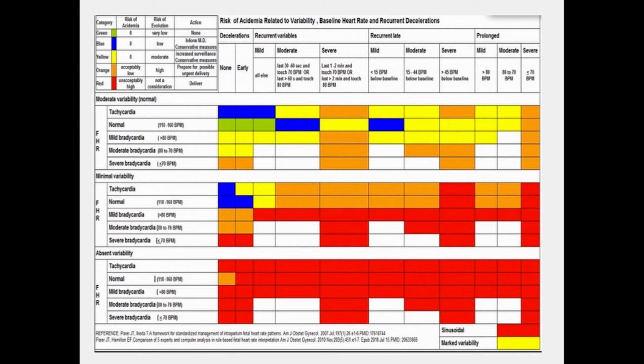And what it turns out is that moderate to severe variables cause more fetal injury than lates. The thing we're all scared of and react to really well are lates, and we don't do as good reacting, and this is not just you guys as a unit, this is in the country, we do not do as good a job of reacting to moderate and severe recurrent variables.